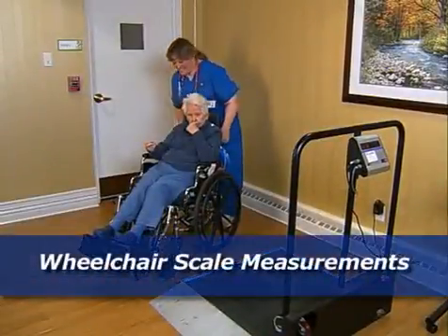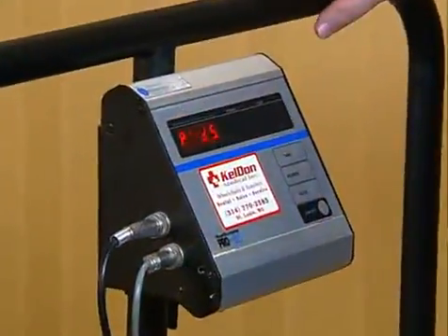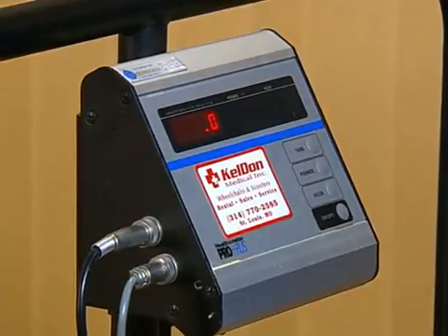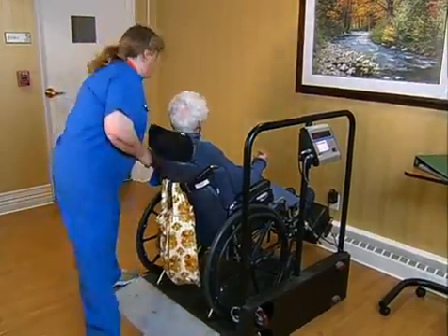For a patient who can't stand, a wheelchair may be rolled right onto a wheelchair scale. For a digital scale, make sure that the reading is 0. Select the unit of measurement, which may be pounds or kilos on this scale. Position the patient and wheelchair on the scale and lock the wheels to prevent rolling.